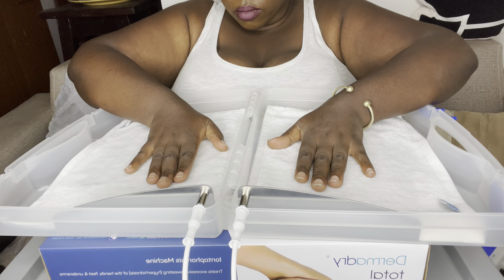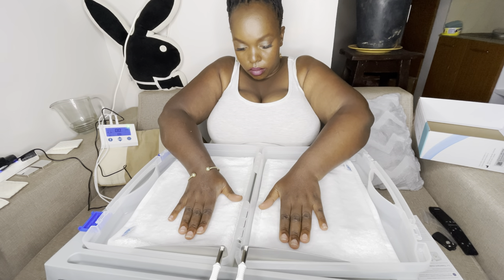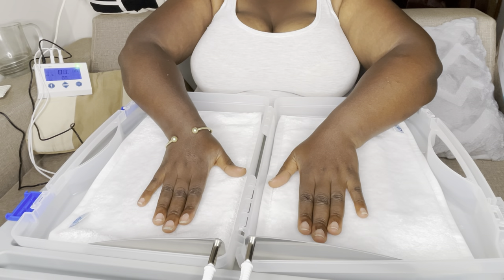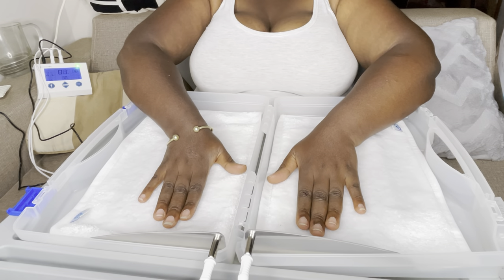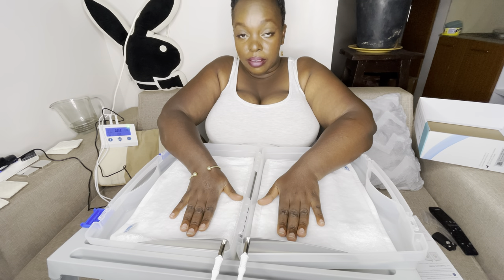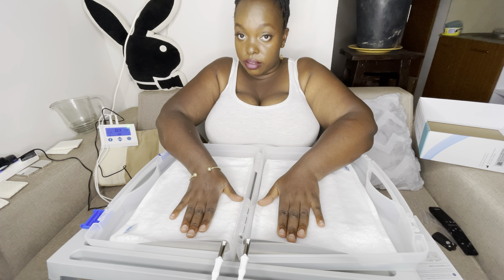DermaDry is a tap water iontophoresis device for single patient use, designed for home use. Treatments are performed by applying an electric current onto the targeted skin areas to treat excessive sweating of the hands, feet, and underarms. Using the device in any other way than its intended purpose may be dangerous. About 20% of people worldwide experience excessive sweating.